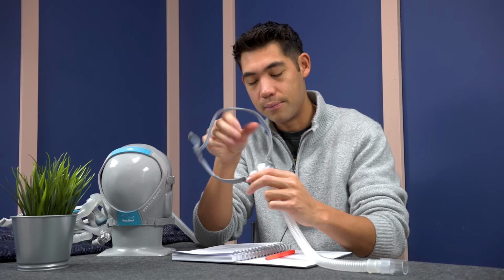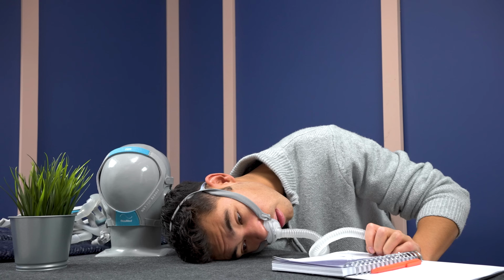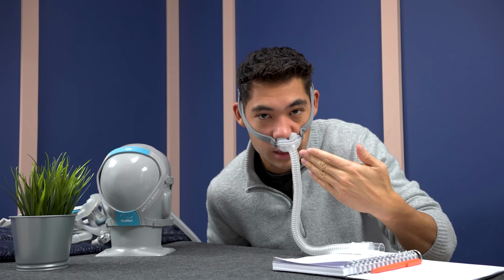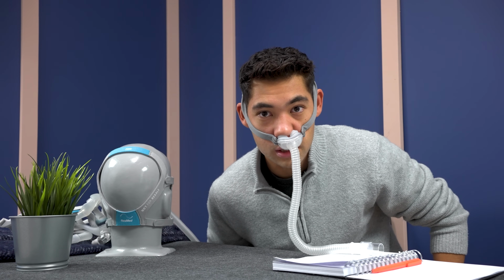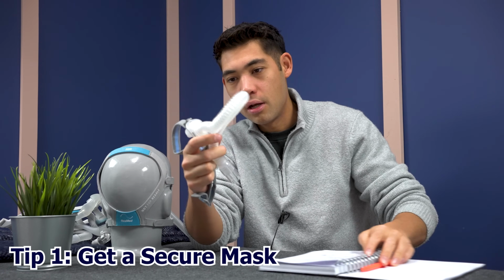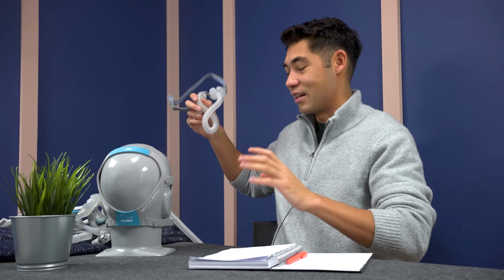When you're wearing it, I shall put it on. Okay, say I'm sleeping on the side and I twist. As you can see, the elastic moves it and it doesn't go back in place. So it's kind of annoying if you're sleeping on your side. I do not recommend having a lot of elasticity in your CPAP mask if you are a side sleeper. Importantly, you should have some forms of adjustment. Okay, so we're gonna put this as not that good.